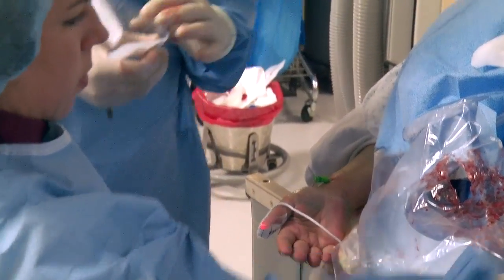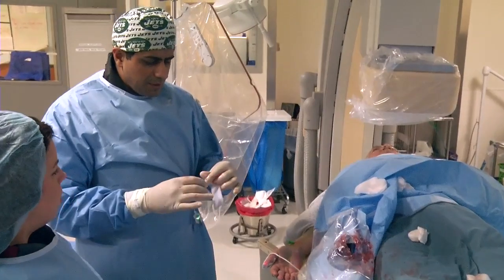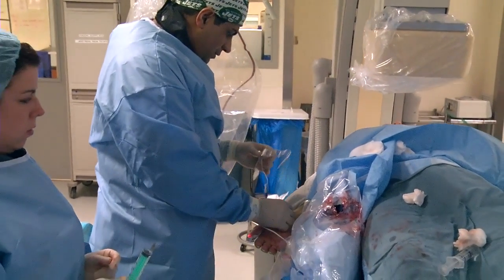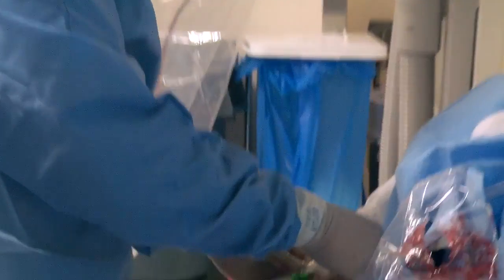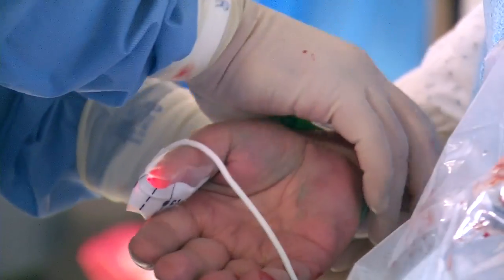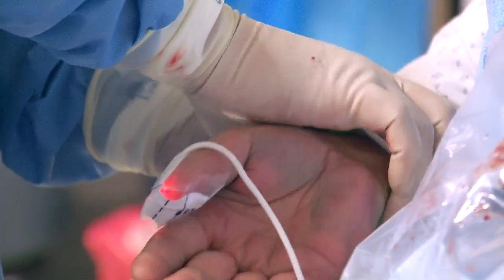So this is the TR band. This is what we're going to use for hemostasis. I'm just going to pull back on the sheath a little bit, and the green dot goes right over our entry site. And then we're going to put it on as we'd put on a wristwatch.